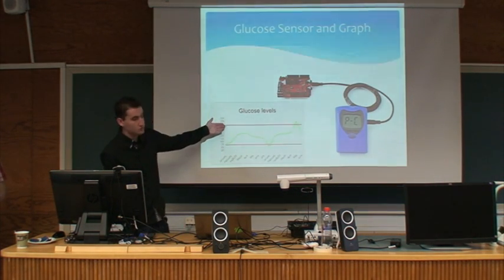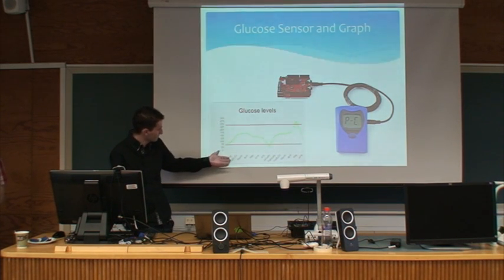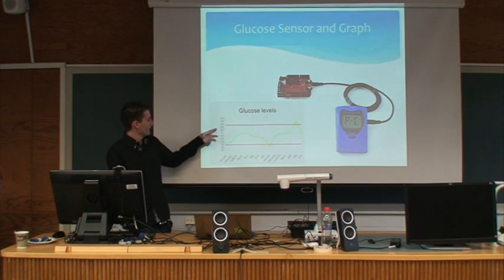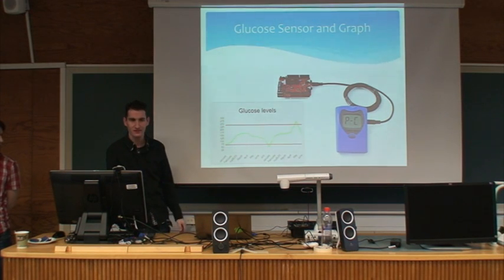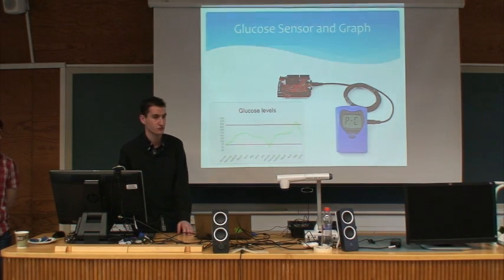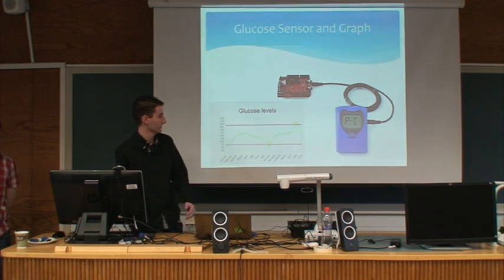Here's, for instance, one of the graphs. It's a template right now, to show something. We have a max value. If you have a glucose level above 240, it's unhealthy, and you receive a red mark on the physician overview, and the physician knows there is something wrong and can check on the patient.